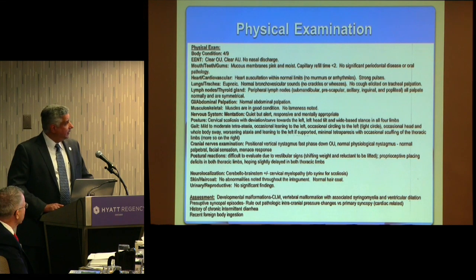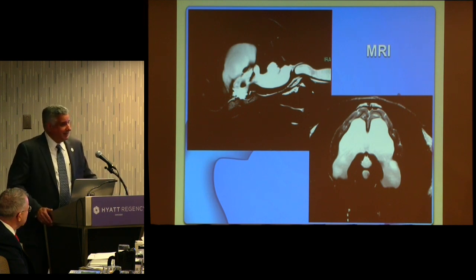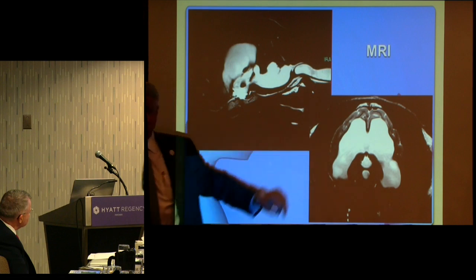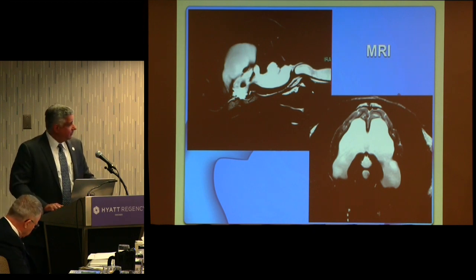They had done an MRI, and their MRI was a low field MRI. I didn't bring it, but this is the MRI that I brought to the meeting. So we have a lot going on. It was quite a busy MRI with hydrocephalus. We have intracranial subarachnoid cysts, profound syringomyelia, and what you might call secondary Chiari malformation from all the action going on in the caudal fossa. And you can see this area here represents functional tissue. This maybe 1 millimeter sliver here and here, with most of the cord being compressed at that junction. I would say maybe less than 5% of the cord left to function, the rest subject to severe compression.